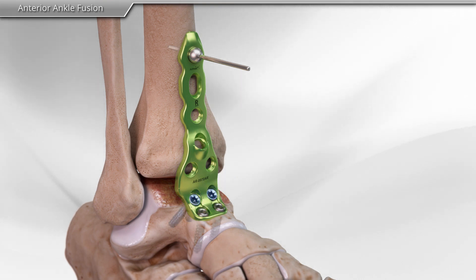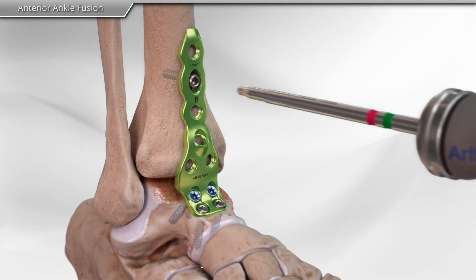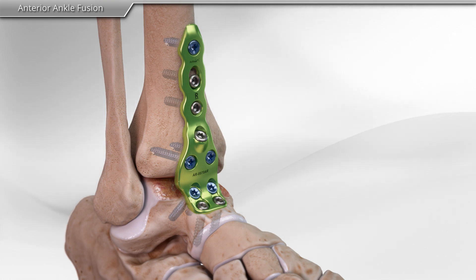Next, using a variety of instruments, your surgeon places screws into the plate, holding the bones of the ankle in position, allowing for bone fusion. This completes the anterior ankle fusion procedure.